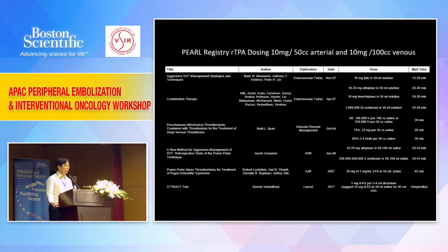The PEARL registry was started by the AngioJet company themselves, and this is just a very busy slide that says that basically many people have their own protocols.